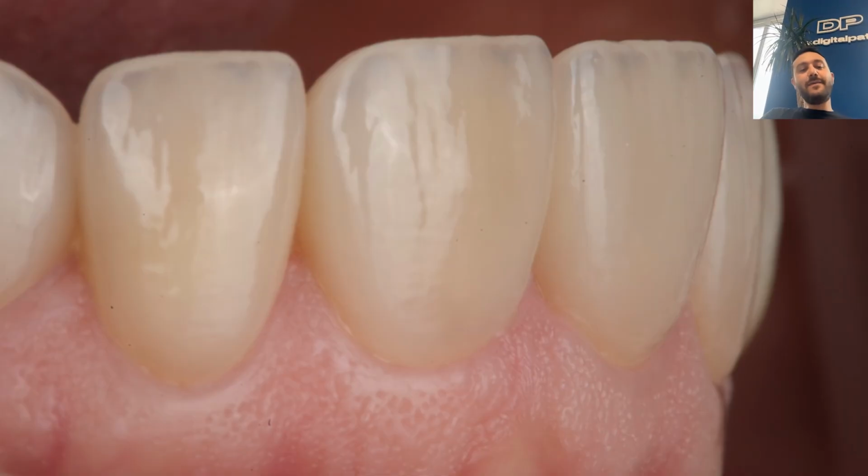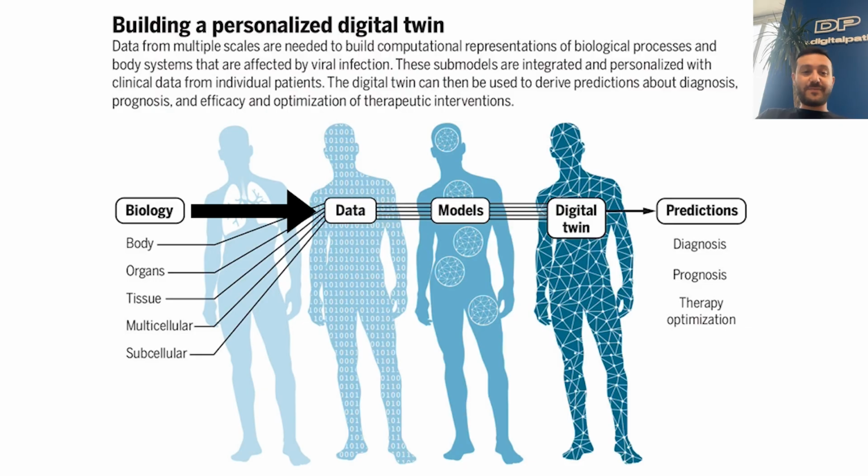Gingival detail immediately after cementation. The seamless integration of soft tissues with the restorations bodes well for upcoming checkups. And so we start with this slide, which is building a personalized digital twin. We start from the biology to go through the predictions, so the diagnosis, the prognosis, and the therapy optimization.